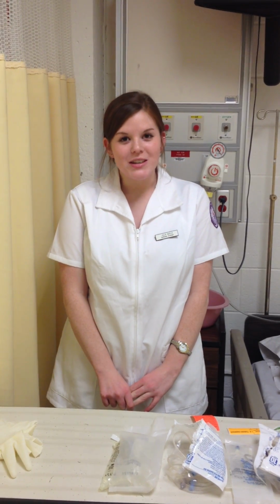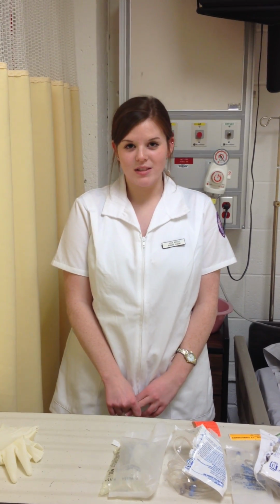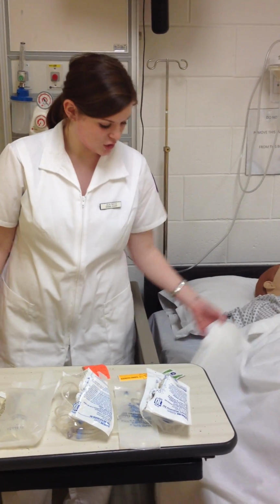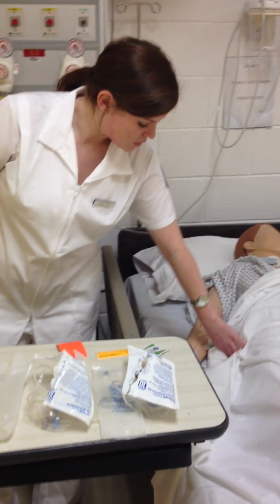The first thing I'm going to do is state the 7 steps: check the physician's orders, wash my hands, identify the patient, introduce myself, explain the procedure, gather my equipment, and provide privacy. Then I'm going to go over to the patient. After I wash my hands and check the physician's orders, I'm going to go over to the patient.